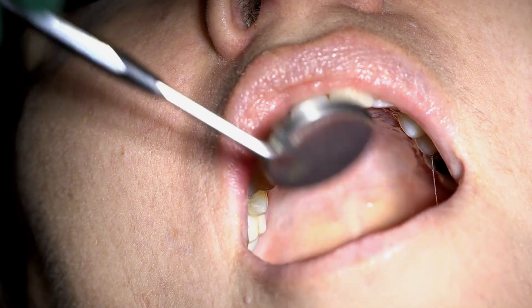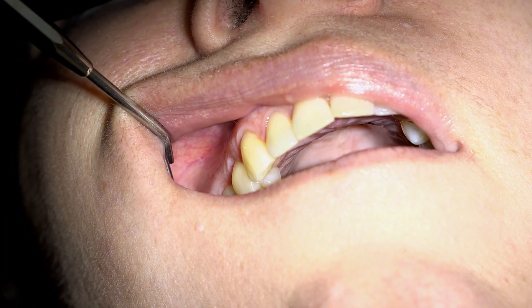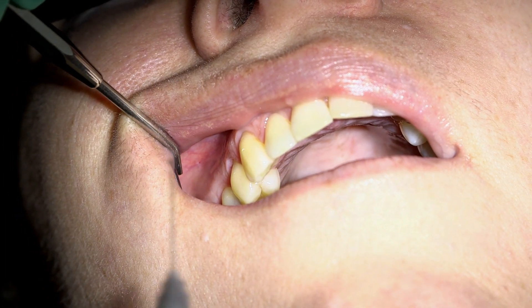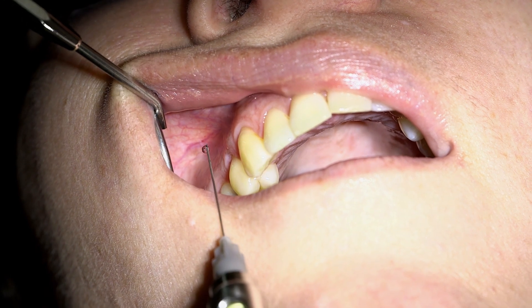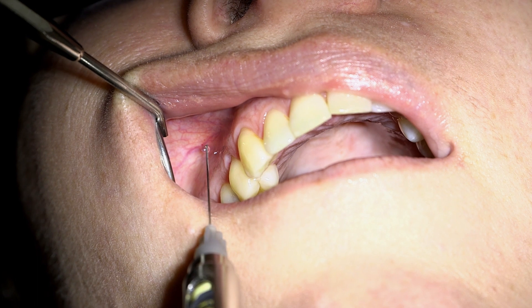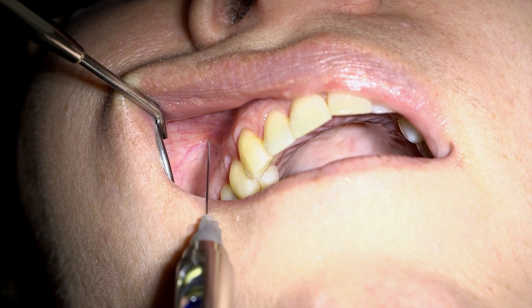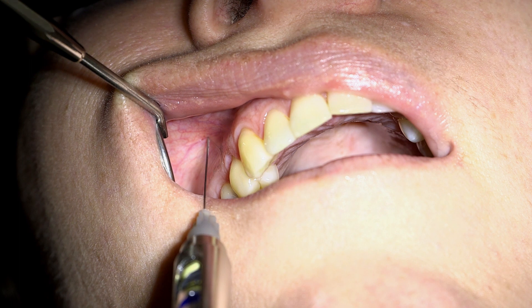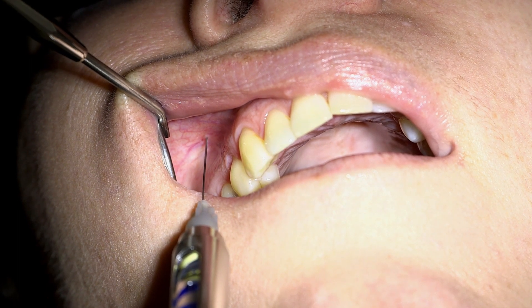A short needle is used for the buccal infiltration. Retract the tissues carefully with your mirror, ensuring the buccal mucosa is well retracted and the tissues are taut. The target bony site is slightly distal and superior to the apex of the target tooth, aiming for the height of the mucobuccal fold. The syringe is oriented so that it is parallel to the long axis of the tooth.